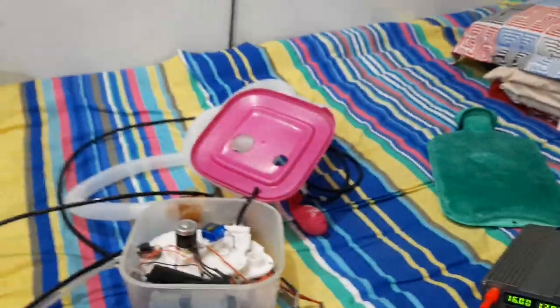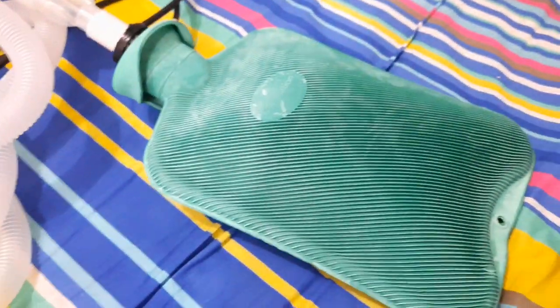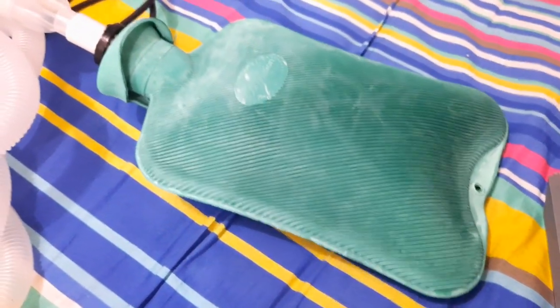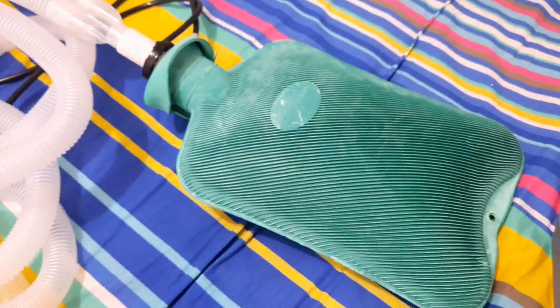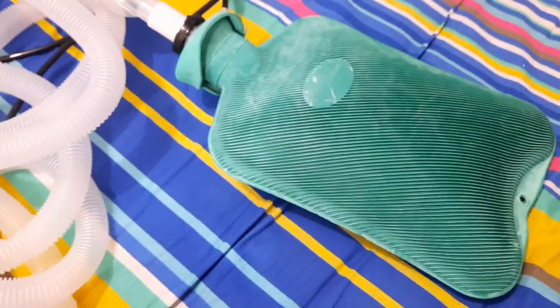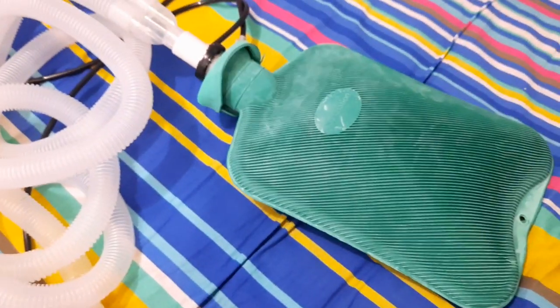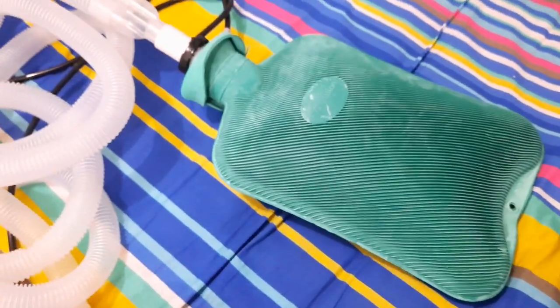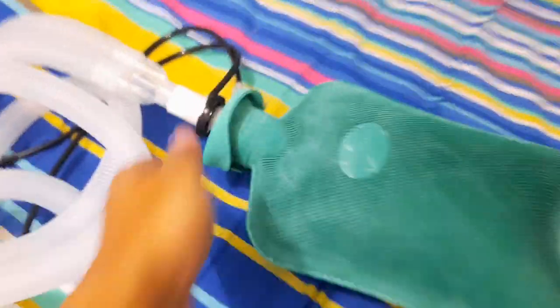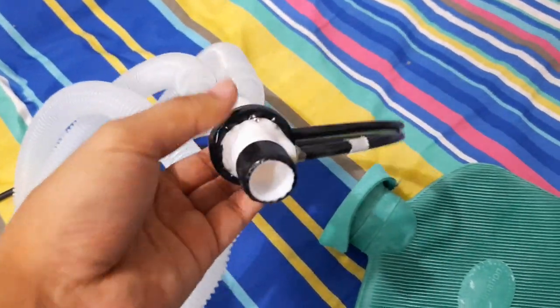Okay, I'm going to replace this balloon with the hot water bag. So I just replaced the balloon with this hot water bag, and in our ventilator we also have some alarm function which is not here right now. This is a very early prototype, but it will have alarm, SIMV mode, assist control mode, and other smart modes. So you can see the orifice tube here.